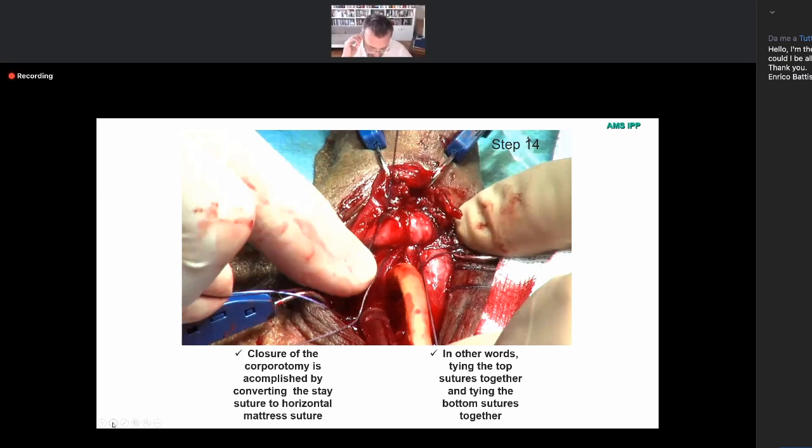I have seen you, in fact, taking out this orange part around the tube when you prepare the device. I think it's better because you are completely sure that you have eliminated all this silicone around the tube, all the Dacron. This is important to keep in mind. Next slide, please.